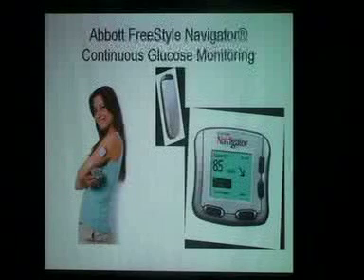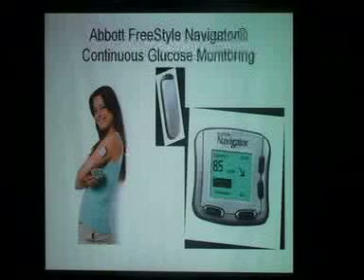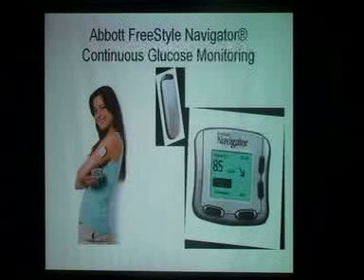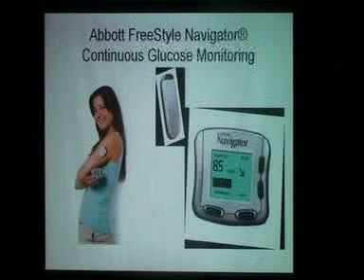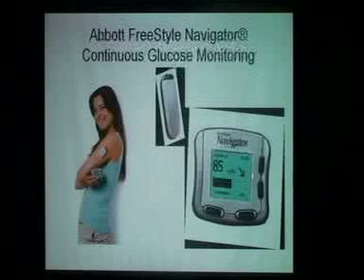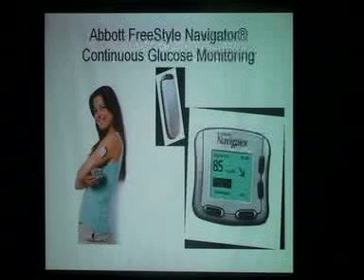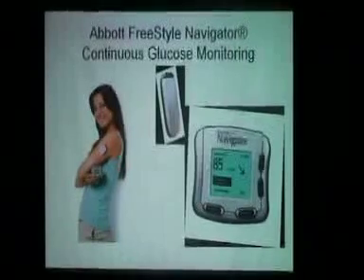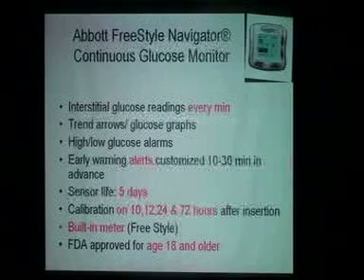This kind of CGM. Basically, this is the sensor that the patient wears, which has to be changed every 5 days, and this is the monitor, or the screen, that shows the blood sugar and the trend arrows, and they can also set alarms and alerts to be alarmed about the highs and lows.